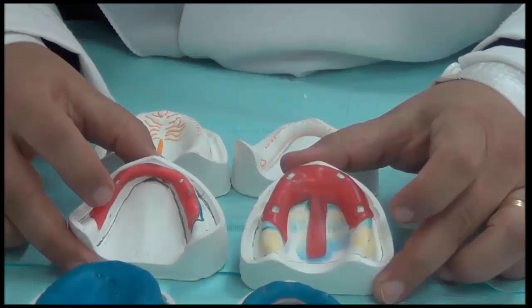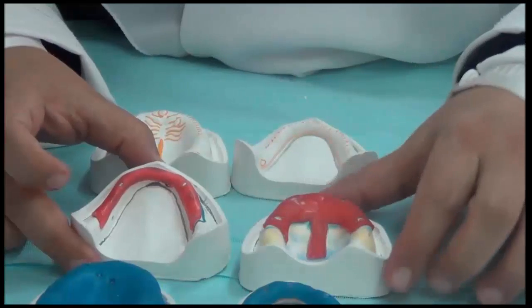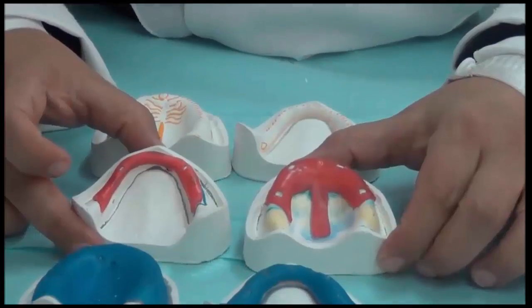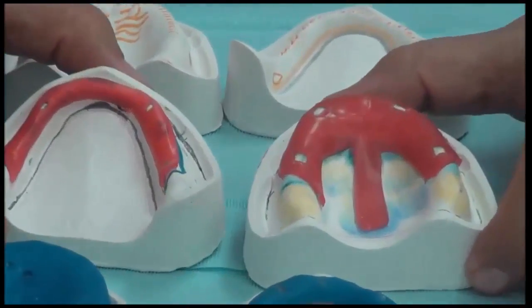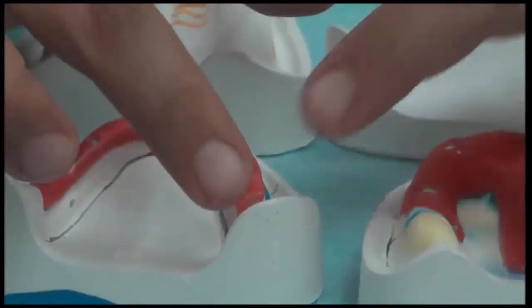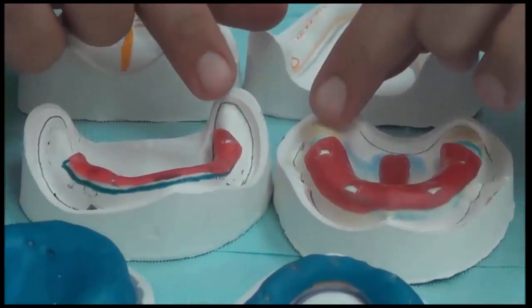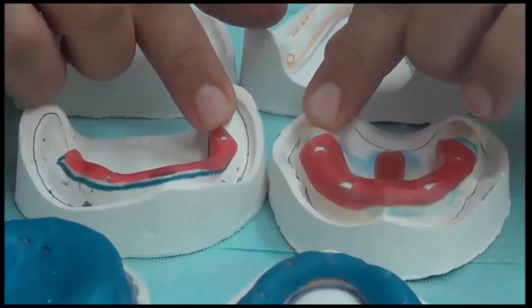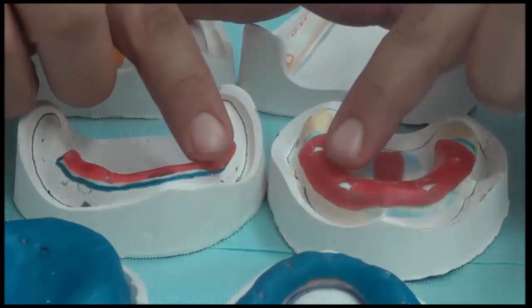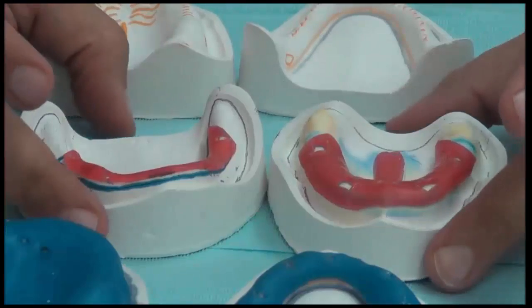So if I make a tray with hard tray material over this wax, in the areas where we have wax, the tray will not come in close contact with tissue. And once I want to begin my impression, I remove the wax, and the impression material here will have sufficient space. While in the support areas, the impression material will be closely and firmly pressed by the tray and the soft tissue, so these are compressed. The areas where the wax was will be mucostatic, not muco-compressive.